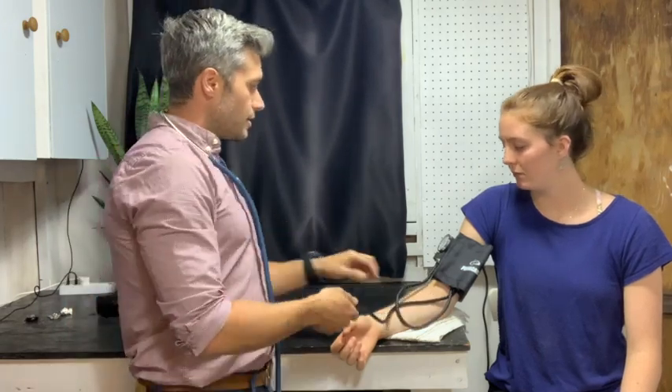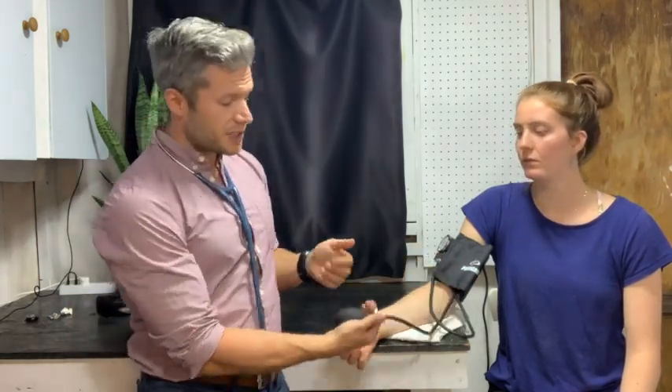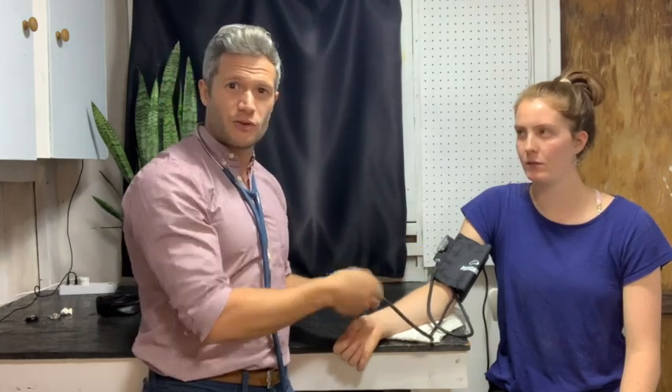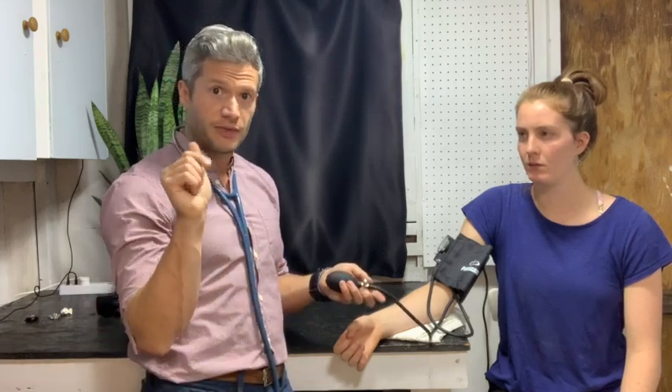More things to help set you up for success: when you go to pump up the bulb, notice which way is open and which way is closed — it's a little tricky sometimes. You can sometimes see a little pinhole on the side of the valve. When you go to tighten it before you start pumping, you really don't want to get in there and crank it. Because ideally, once you start letting air out of the cuff, you're just going to be able to flick it very, very lightly to open it up — just having a small amount of air coming out of the valve with a little bit of pressure release is what you're after. If you really crank it on there, you're going to need both hands to reopen it, and typically what happens is you overshoot with how much air can come out of the blood pressure cuff.